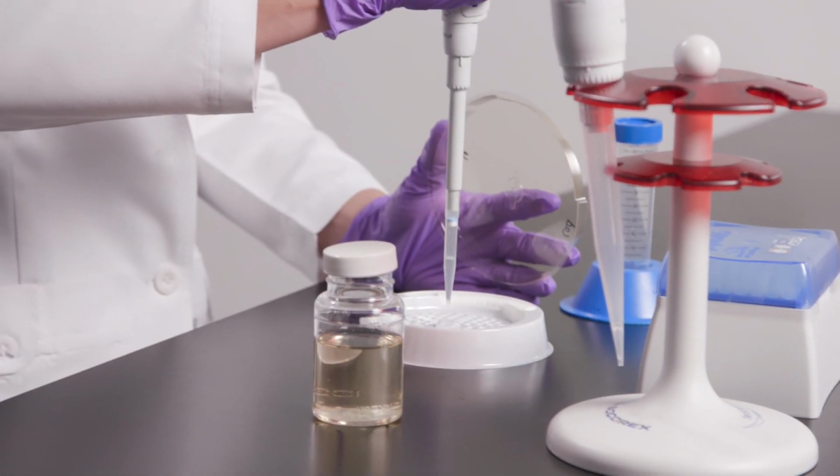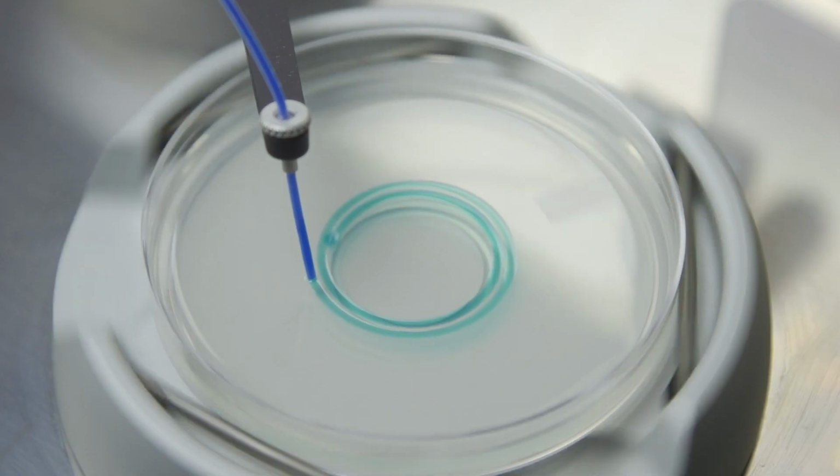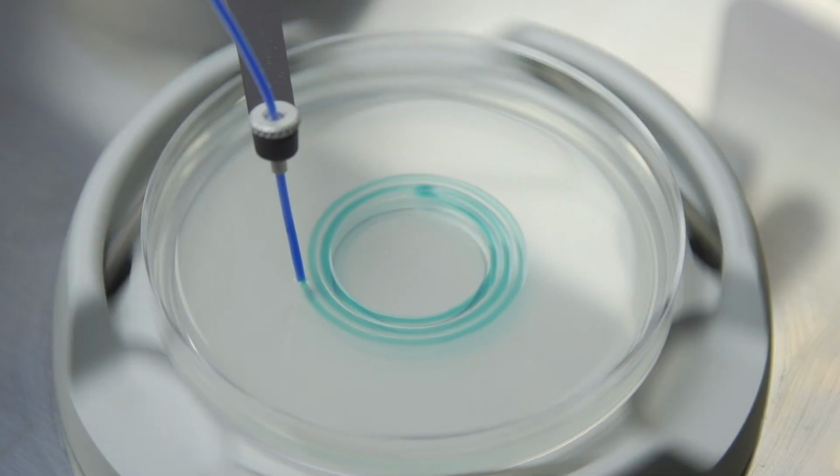We have two methods, enzyme substrate and R2A spread plate. Both methods are EPA registered to test dental water. Do note, there's an in-office test method to test for bacteria, but it is not EPA registered to test for dental water. The enzyme substrate method delivers test results in 2 to 3 days, while the R2A method delivers test results in 5 to 7 business days.